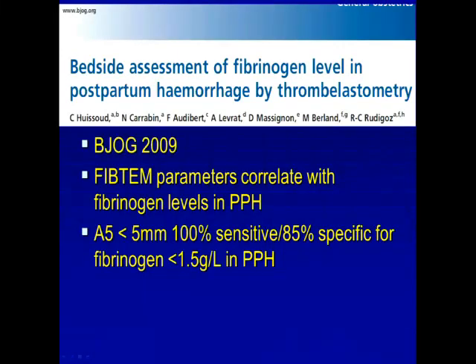In the ideal scenario, like the Europeans, the surgeons are really involved, and they have a plot forming on one of their monitors in the OR. So it's actually real time. They look up and they've got that plot. It shows you the curve as it's forming. Are we going to have that access? We don't have a lot of monitors other than OR 12 and a couple of ORs, but certainly you'll be able to access it in the operating room.